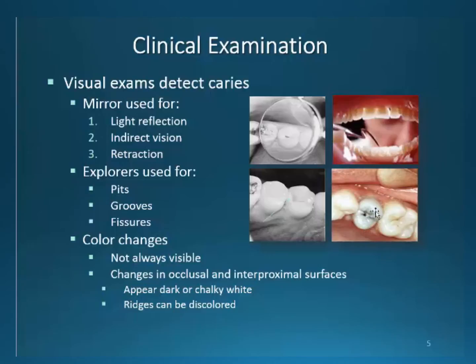I have my cursor laying over one of these areas — notice the change in the whiteness of this tooth that has quite a bit of decay in it. This arrow is also illustrating this whitened area and then the darkening on the proximal surface.